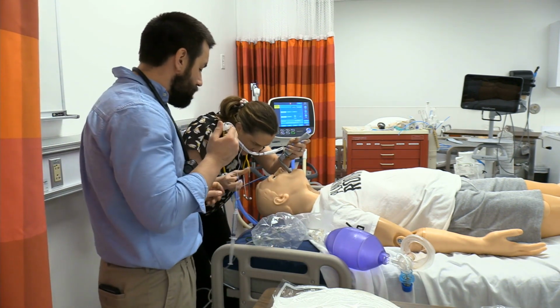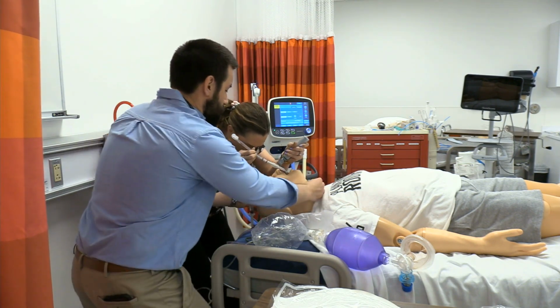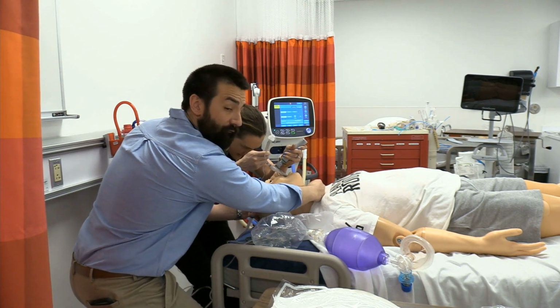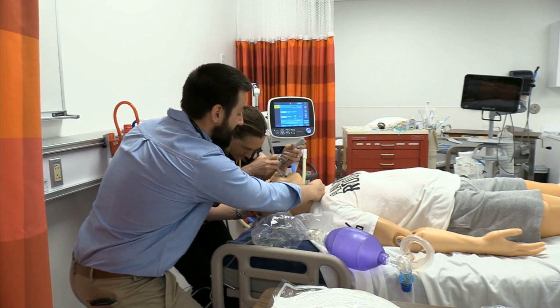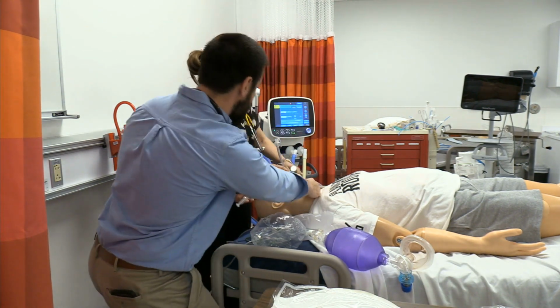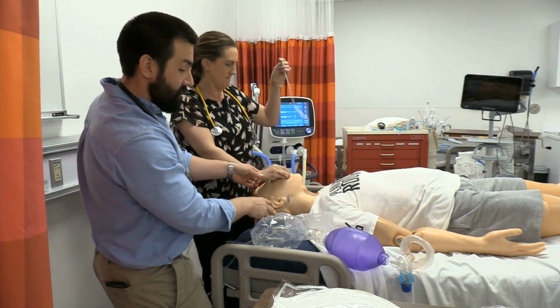Tube? All right, I would like a tube. I think, would you like maybe just a little bit of cricoid pressure? Just a little bit. On the patient? Yes, please. Yes, thank you. I appreciate that. So firm upward and inward pressure should be enough, where it hurts your nose if you put that pressure on there. Are you in? I think so. All right, I'm in. Please hang on to that tube. All right, cuff is up, stylet's out.